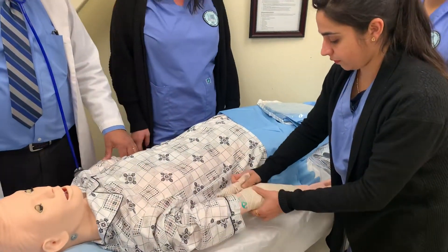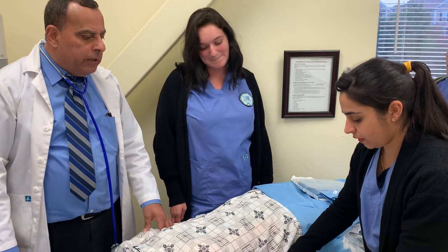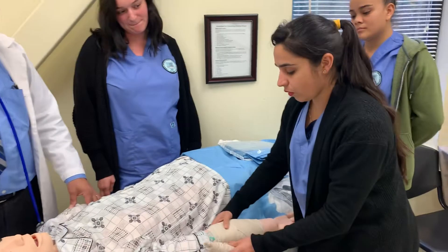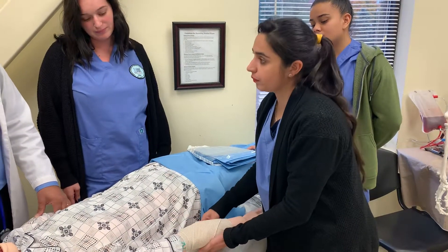We know that we have many types of bandage. Amanda, what types of bandage do we have? The bandage and the elastic bandage.